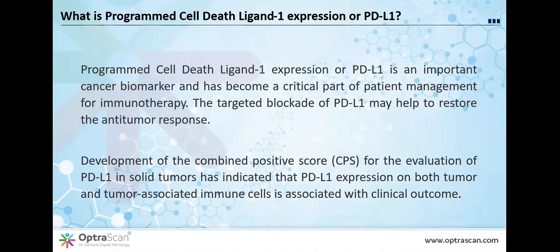A number of years ago, investigators and big pharma recognized that it might be possible to block the PD-L1 blockade by using antibodies against PD-1 or against PD-L1, the ligand. Fortunately or unfortunately, a number of different antibodies were developed, monoclonal antibodies, and different companies pursued these antibodies in the US through the FDA for approval.